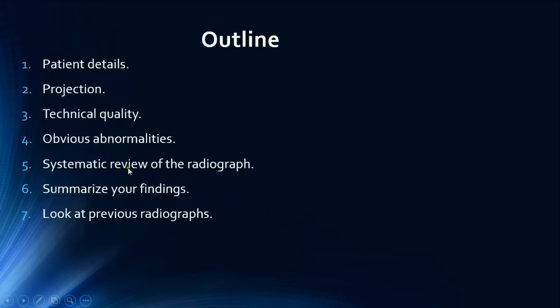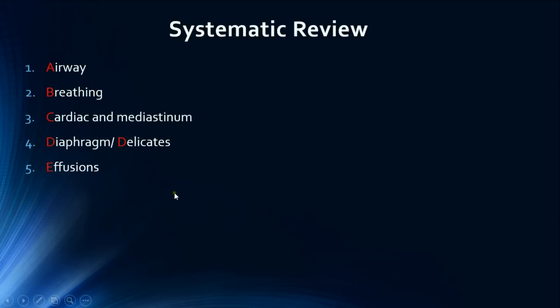Now for the systematic review of the radiograph, we use the ABCDE approach. A is for airway — the trachea — and the most important thing is whether it is central or deviated. B is for breathing — we inspect all lung fields for any lesions, paying special attention to the apices, the hila, and the costophrenic angles, as these areas are commonly missed. C is for cardiac and mediastinum — we look at heart size and any mediastinal widening, such as in masses or hemorrhage.